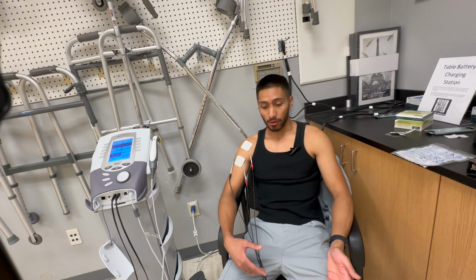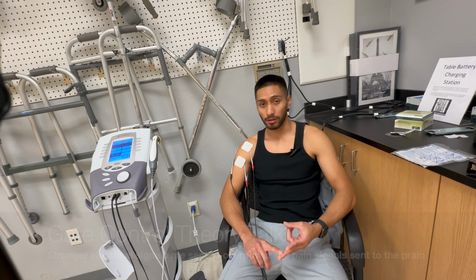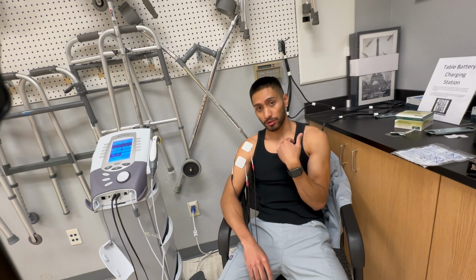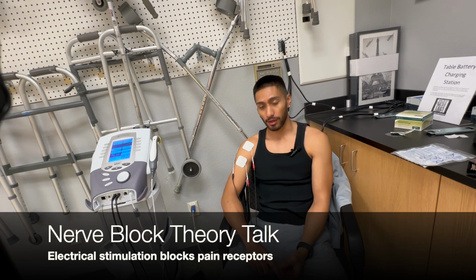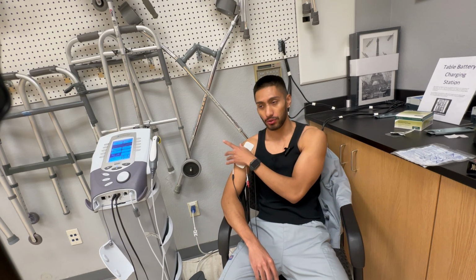To discuss more about gate control theory, like I said, beat low would be 80 hertz, beat high would be 150 hertz, and the carrier frequency would be 4,000 hertz. That's to send stronger electrical signals towards the brain to block off those pain receptors. And then with the nerve block, it would be similar: beat low of 80 hertz, beat high of 150 hertz, and 5,000 hertz for the carrier frequency, which would block off the nerve signaling to that area.